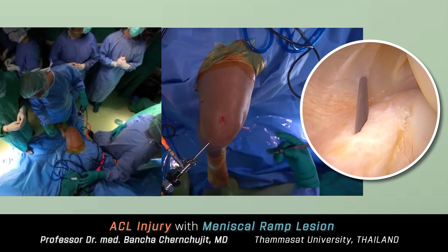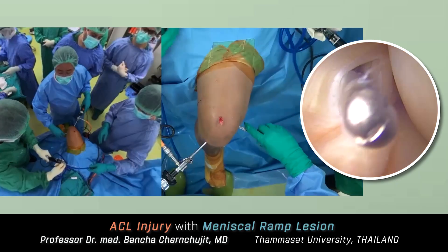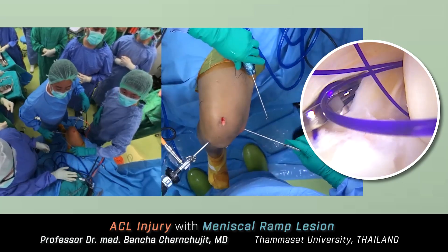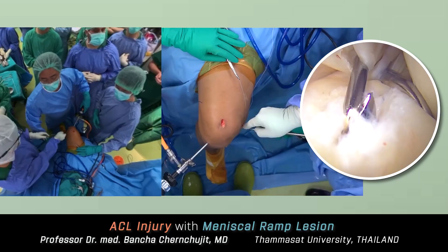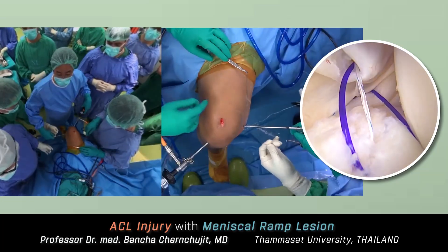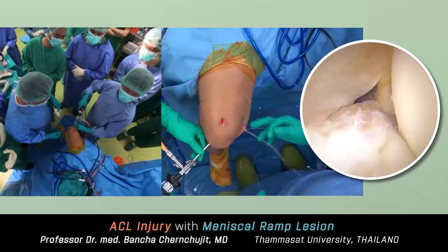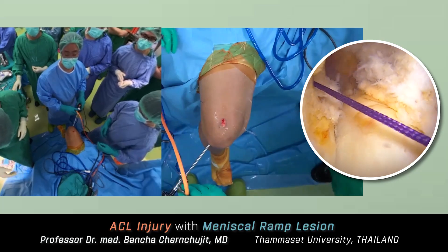When you switch off the light, the transillumination becomes very apparent, allowing you to avoid damaging vessels and nerves. The ramp lesion was repaired using two posteromedial working portals — high and low. I used only non-absorbable sutures and no additional implants. I made two bites: one from the capsule to the tear site and the other from the meniscus to the tear site — together they make one big bite. One stitch is enough; the healing potential in this vascular zone is good.